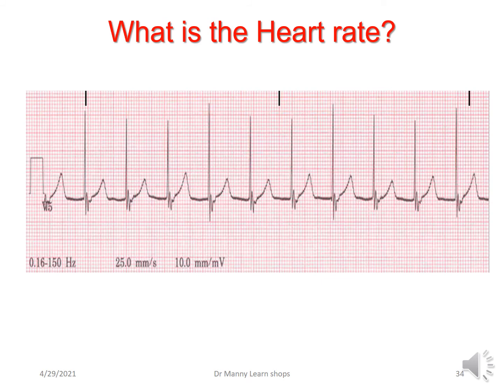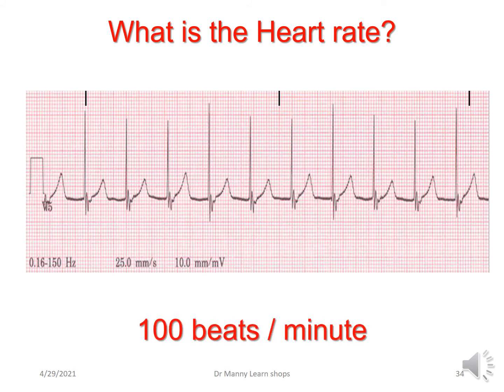What's the heart rate in this rhythm strip? Remember, you only count the complexes between the three lines — or in actual fact, the two outer lines, which is the six-second rhythm strip. The heart rate is 100 beats per minute because there are 10 cardiac cycles: 1, 2, 3, 4, 5, 6, 7, 8, 9, 10.